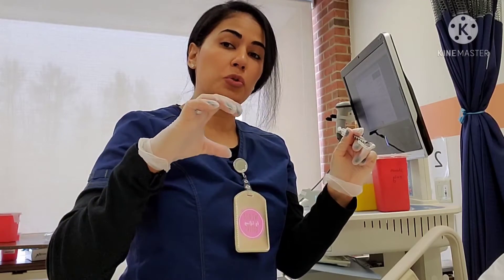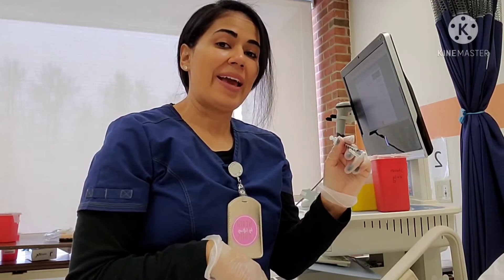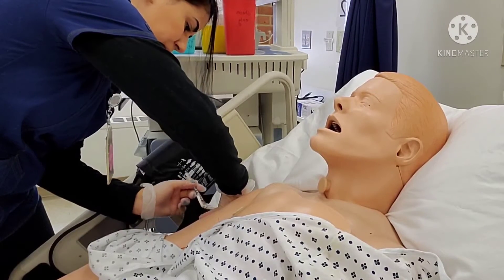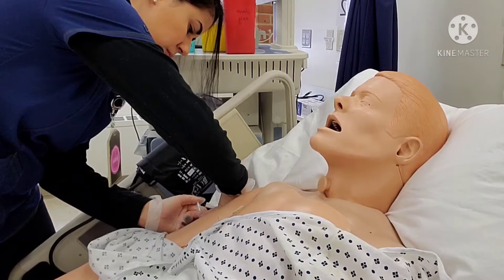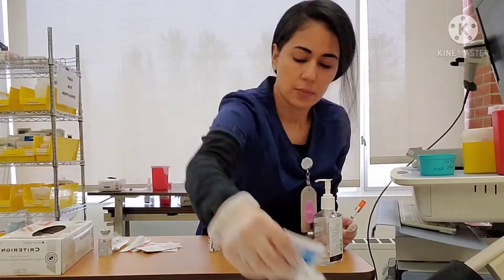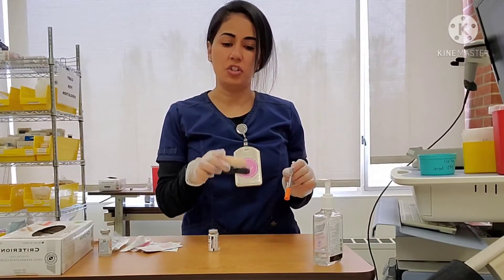I'm going to pinch my skin and inject the needle at a 45 to 90 degree angle, then secure my syringe and inject the medication. I'm going to remove the needle, activate my safety, and put it right into my sharps container. I wanted you to see what that looks like administering to a real patient, but I also want to show you how that looks on the injection pad.